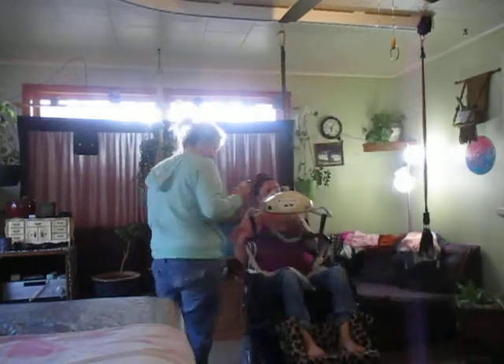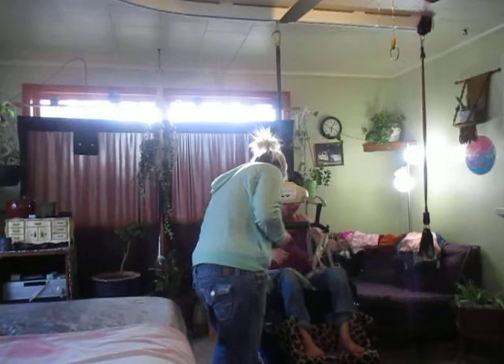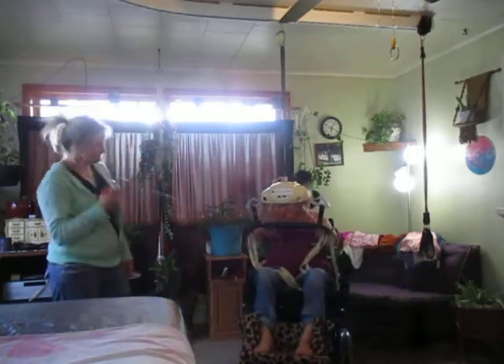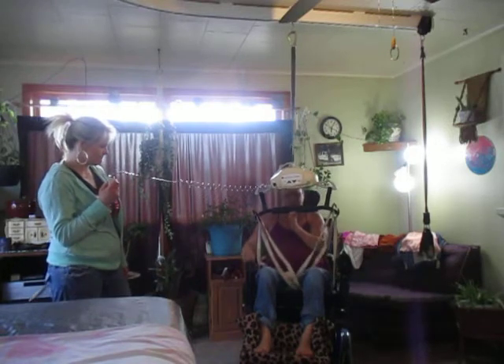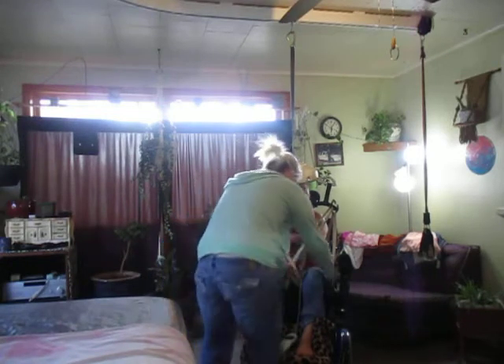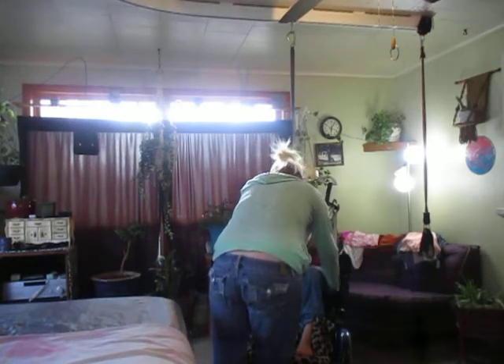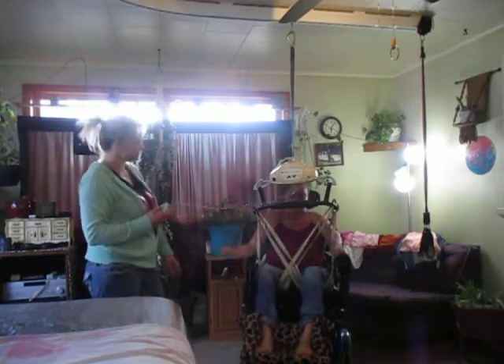It's funny when I bring my nurses in. Once we get it tight, go ahead and tighten it up, so I don't get lifted like I'm wearing a G-string. Go ahead, Tana. We pull it, one hand each side under the thigh, and we pull it towards the knee. This is the correct way to put the sling on.